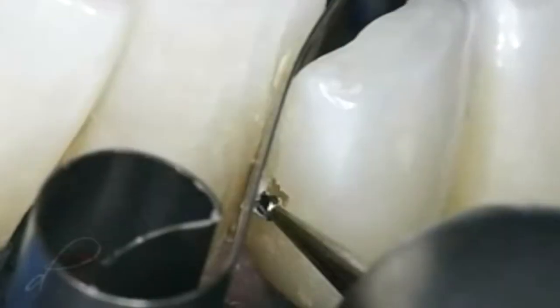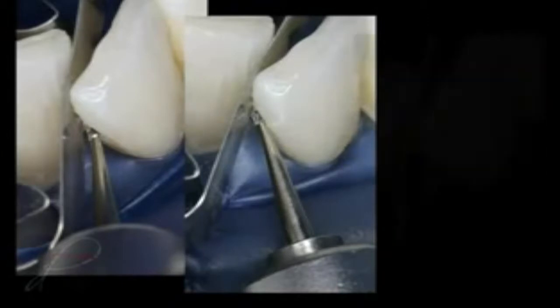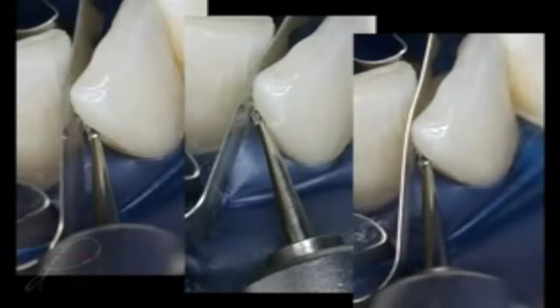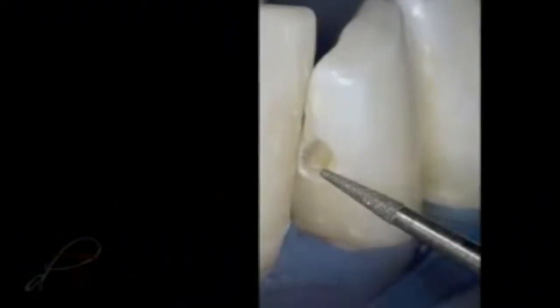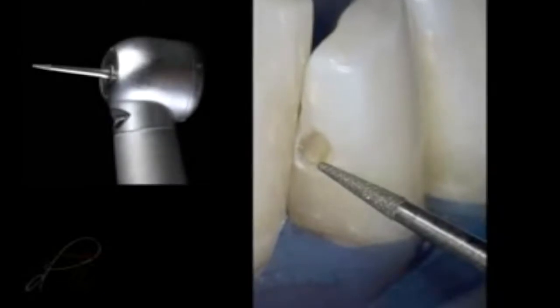Once anesthesia had been administered to the patient, the caries was removed with a number 2 high-speed round bur, which produces rounded line angles. The outline form was as conservative as possible, without removing healthy tooth structure, unless dictated by caries. A circumferential bevel is placed in enamel using a tapered diamond bur, a DET3 by Brasseler USA.